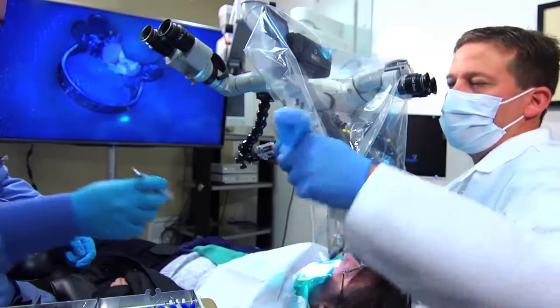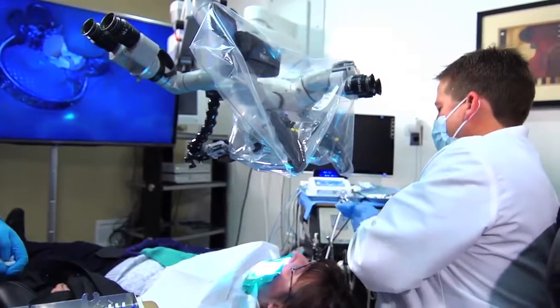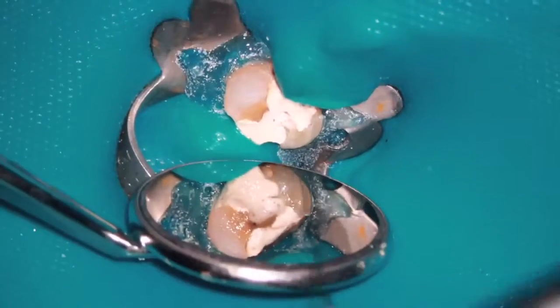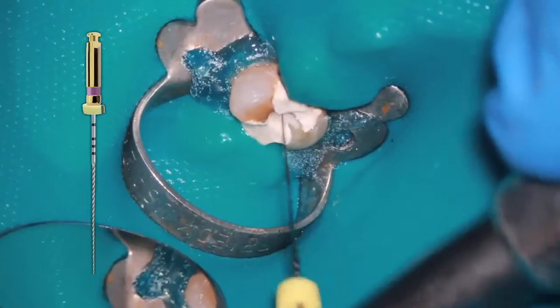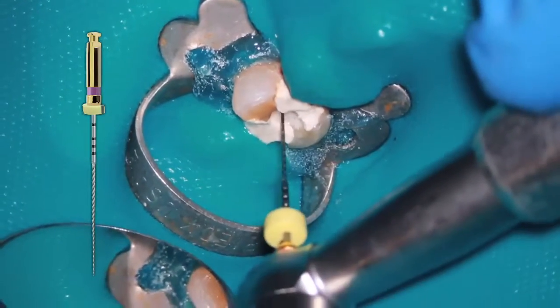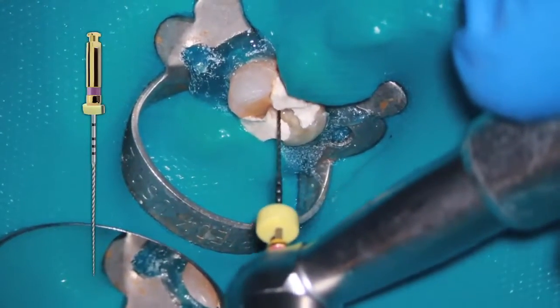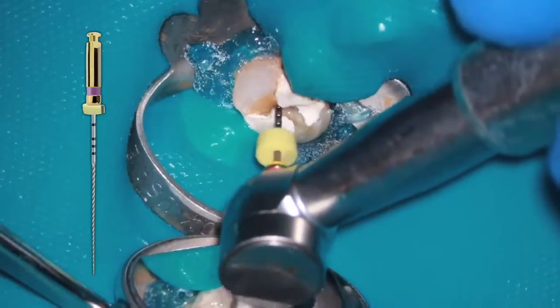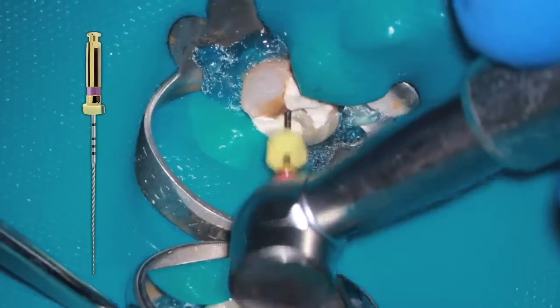We're going to start off with a path file number 13. That's our purple band, and as we know, it has an .02 taper. With irrigant in the canal, I'm now going to use my rotary instrument to confirm my glide path, and here it is. We always want to make sure that we don't start it in the canal, so I do a dress rehearsal, 1, 2, 3. It's not binding up top, so I'll pull it back out like this, and now activate before I enter in, and a nice smooth 1, 2, 3.